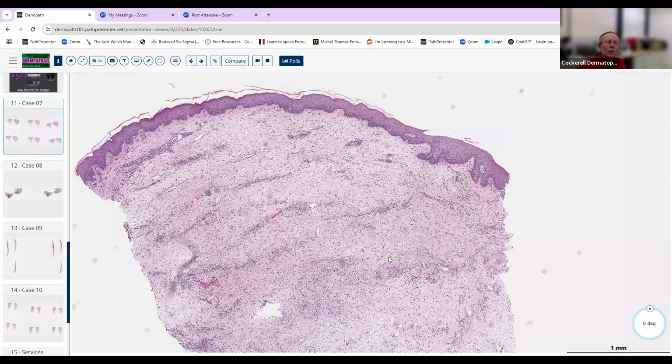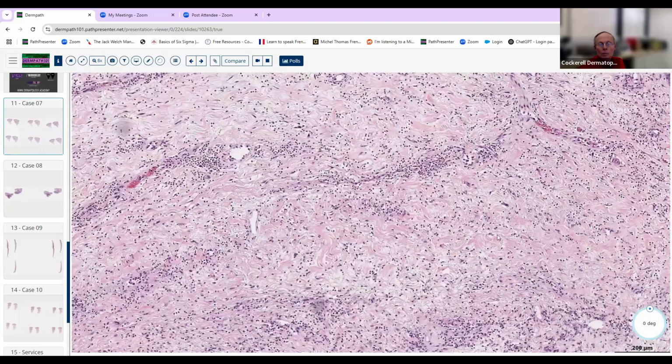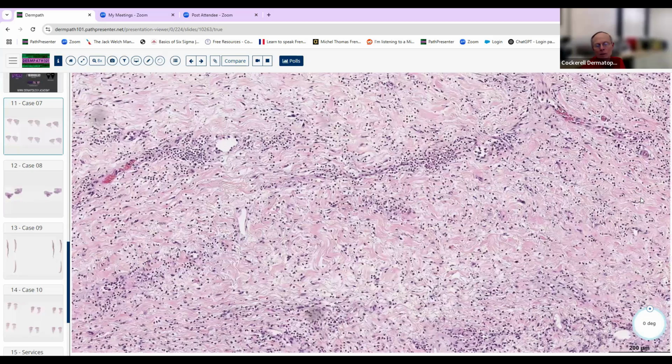So when you see neutrophils mostly in an interstitial pattern like this, where there's a diffuse interstitial pattern, we start thinking of a relatively few number of items in the differential diagnosis. The first thing I would think about would be cellulitis. With this many neutrophils, relatively dense, almost the entire dermis is involved here. And there are some EOs, but anytime you get neutrophils, you get some EOs in there as well. That would be my number one diagnosis if I saw this.